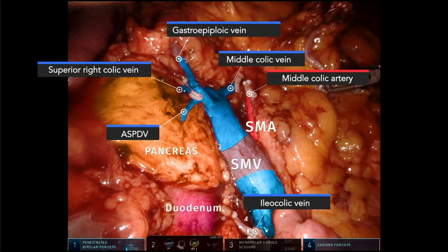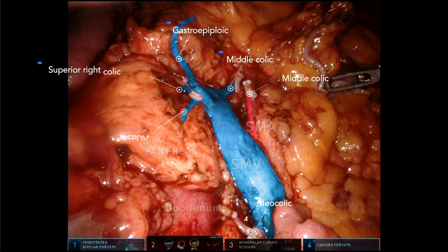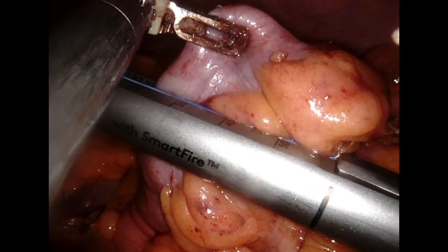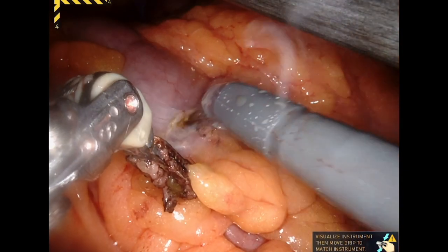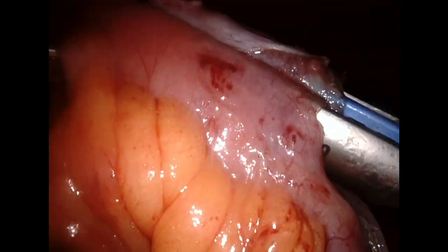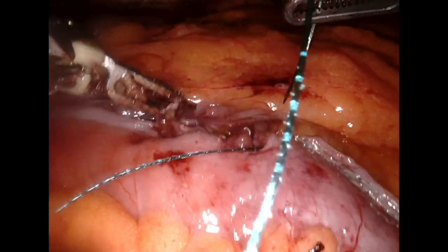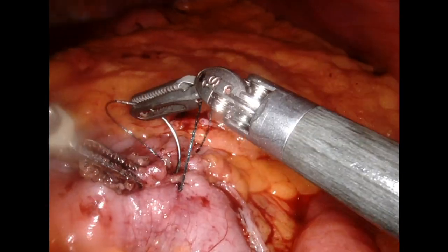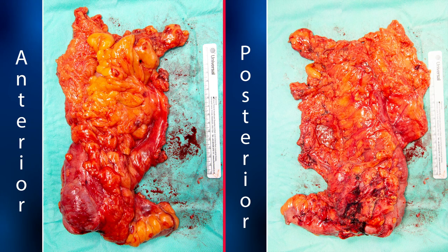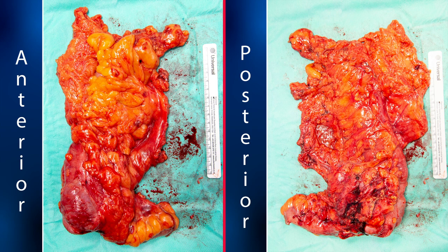The post-dissection anatomy is then inspected. We then enter the lesser sac by dividing the gastrocolic ligament and preserve the gastroepiploic arcade, which is not depicted in the current video. The hepatic flexure and lateral attachments of the colon are divided. The bowel is divided with an endo-GIA stapler, and an intracorporeal side-to-side isoperistaltic anastomosis is created. The specimen is removed via a right iliac fossa incision. Standardised photos of the anterior and posterior aspects of the specimen are taken, and the specimen was graded as mesocolic on histology.